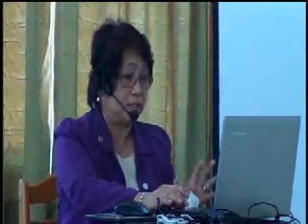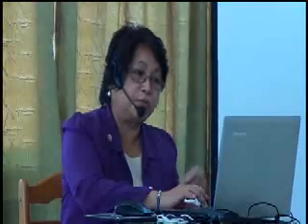The characteristics of the lateral flow test should be the following. It should be accurate, and easy to use and interpret, so that anybody can pick it up and use it without going to school to learn about it. It should be at least not expensive. You can bring it anywhere. Stable, it can last maybe 1 to 2 years. Of course, it's acceptable, and you can produce it in mass quantity. The next slide will show you.